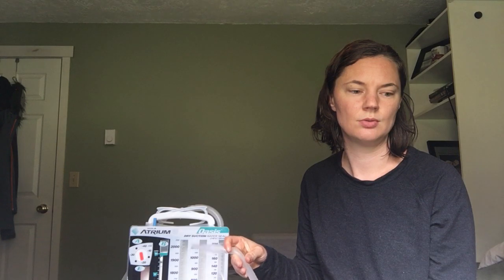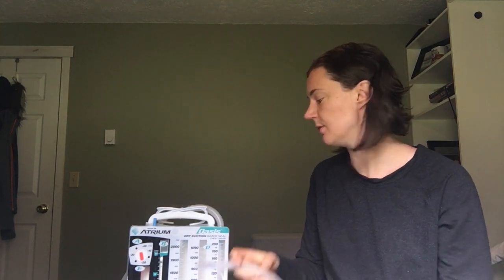And if your chest tube just falls out, the whole thing just comes out of the patient, cover that site up with a 2x2 and a Tegaderm, and call the doctor. They probably need a chest x-ray to see if they're okay with it out. Do a set of vitals in both cases. If it comes disconnected, or the other way, do a set of vitals, make sure your patient isn't needing more oxygen, just watch and monitor them, and give them what they need to keep their vitals stable.